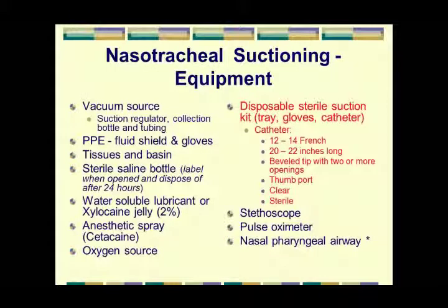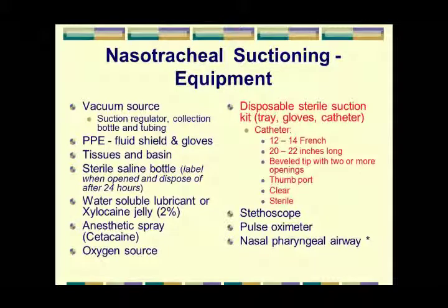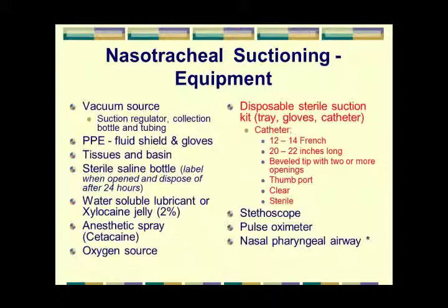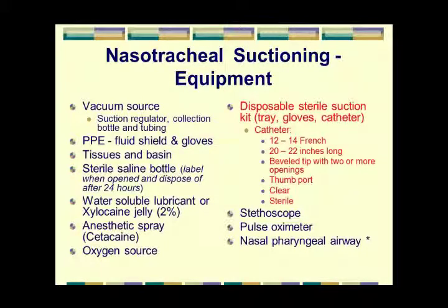Okay. So, again, my disposable sterile suction kit. The rest of the stuff is pretty much the same. But my disposable sterile suction kit has a suction catheter that is measured in French sizing, and I'll talk about that in a sec. It has a certain length, just under 2 feet. It seems awful long, I don't think it's quite that long.